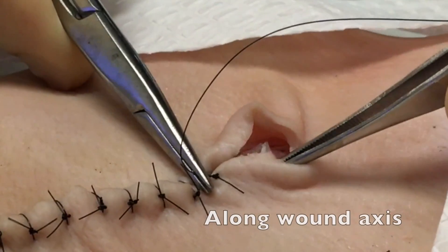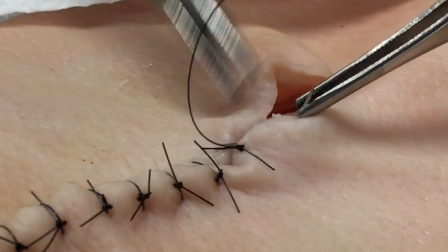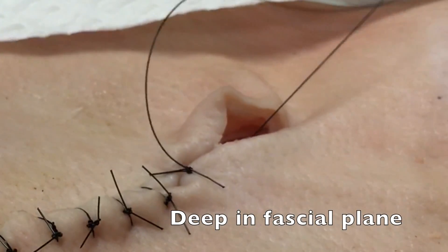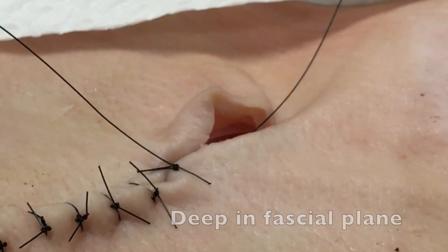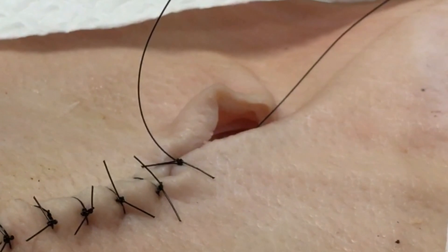A few millimeters beyond where the last simple interrupted suture is placed, you'll go along the wound axis, throw your suture deep in the fascial plane, grabbing those underlying tissues, and come out within the wound right at the point where the dog ear begins.